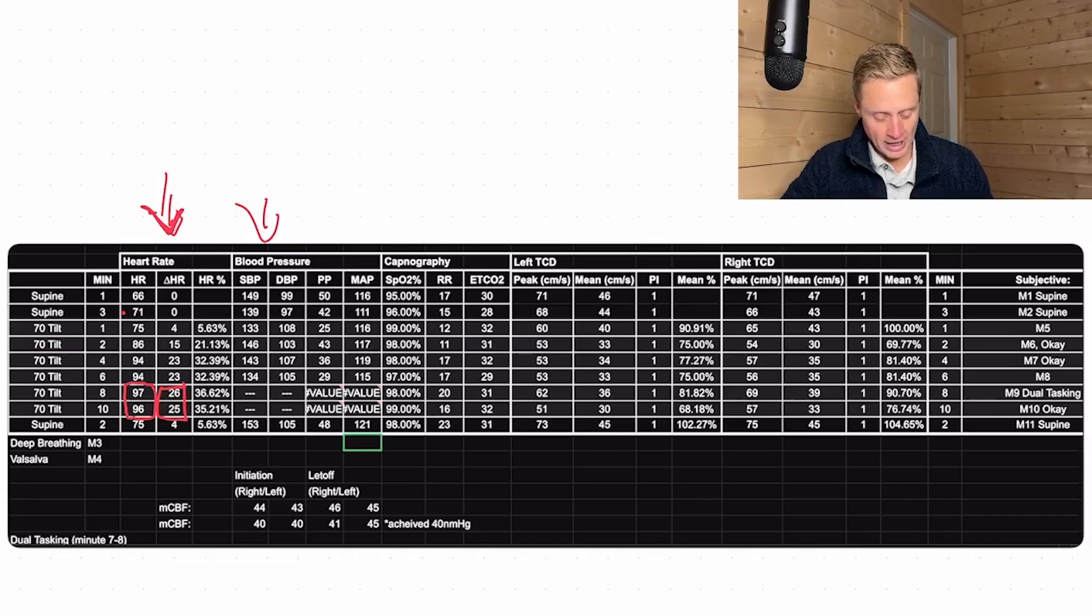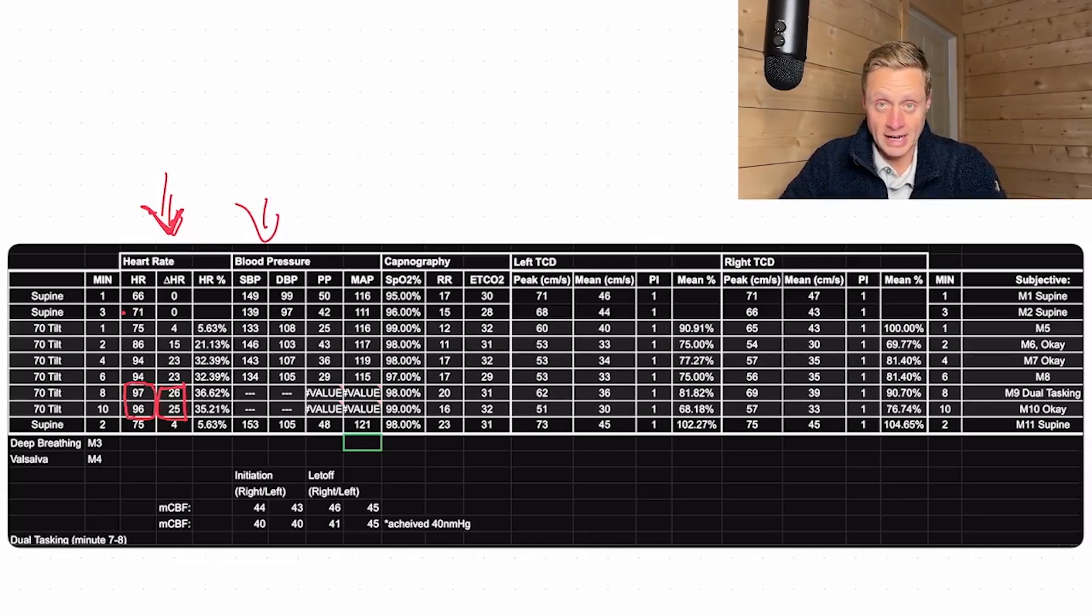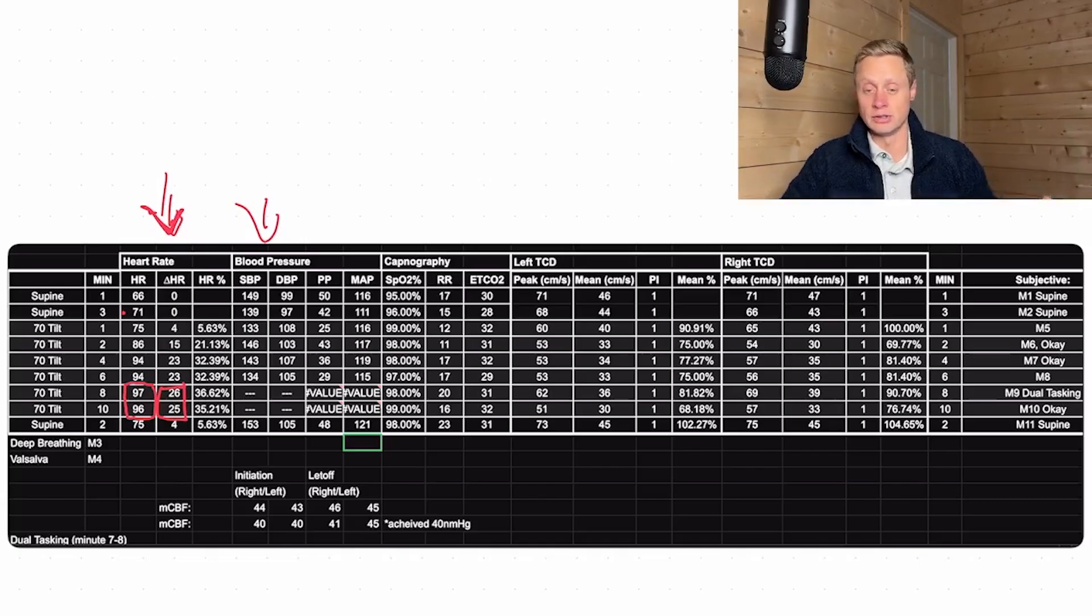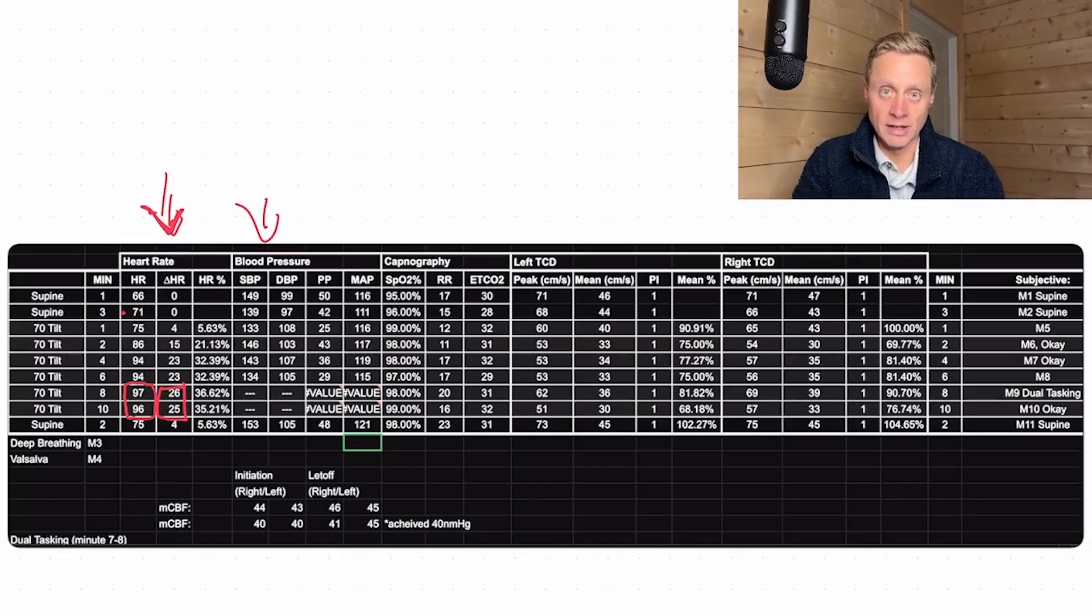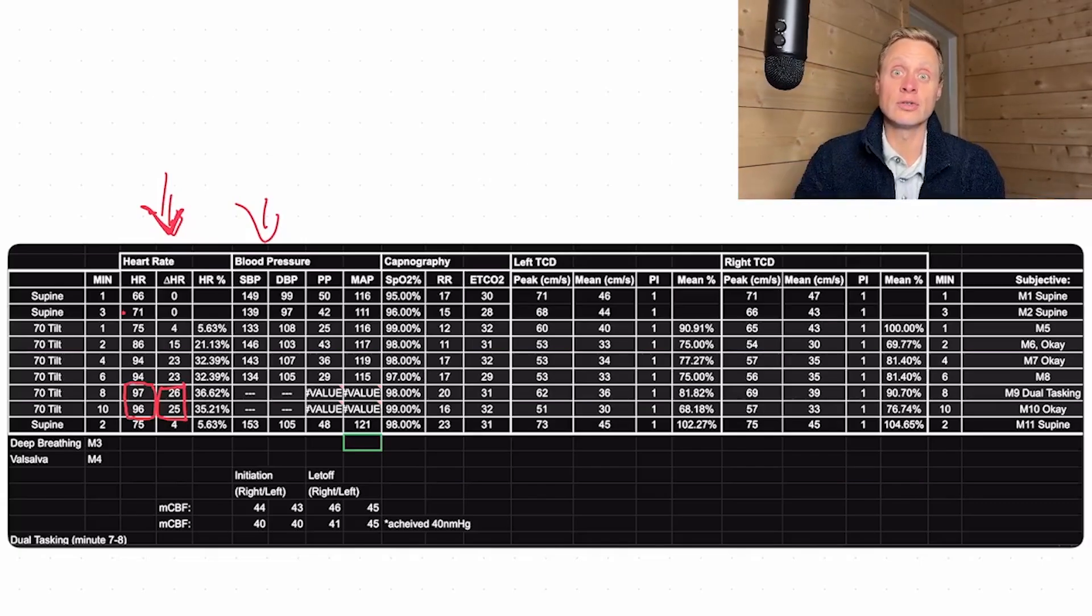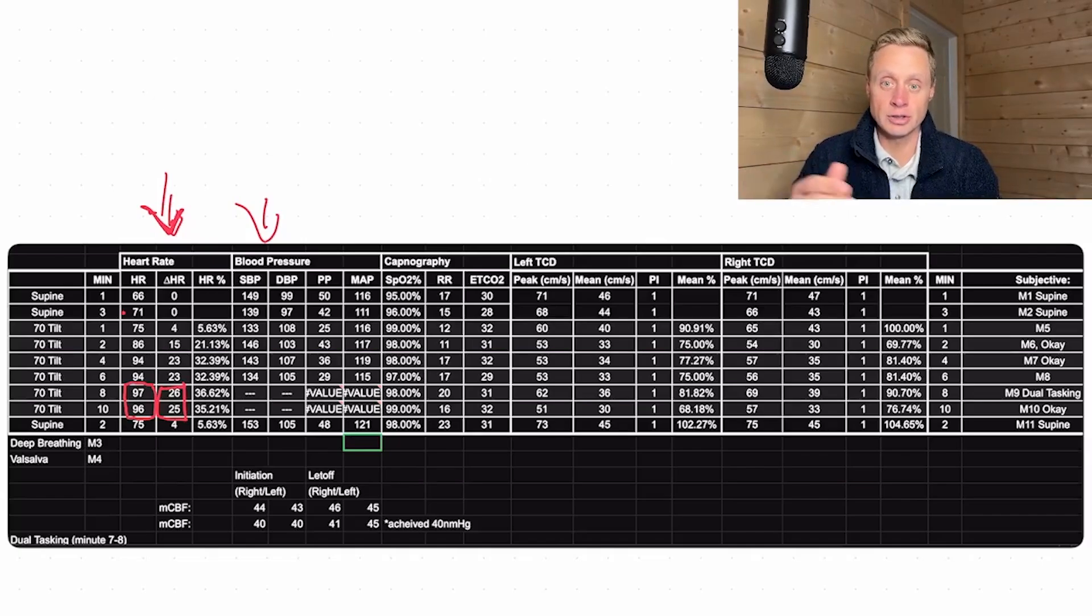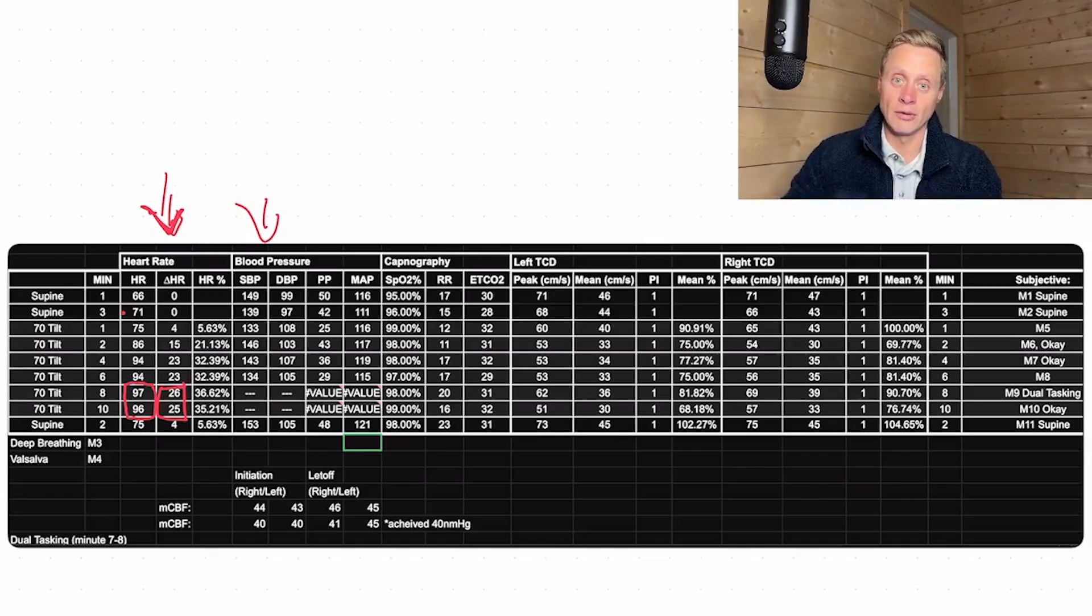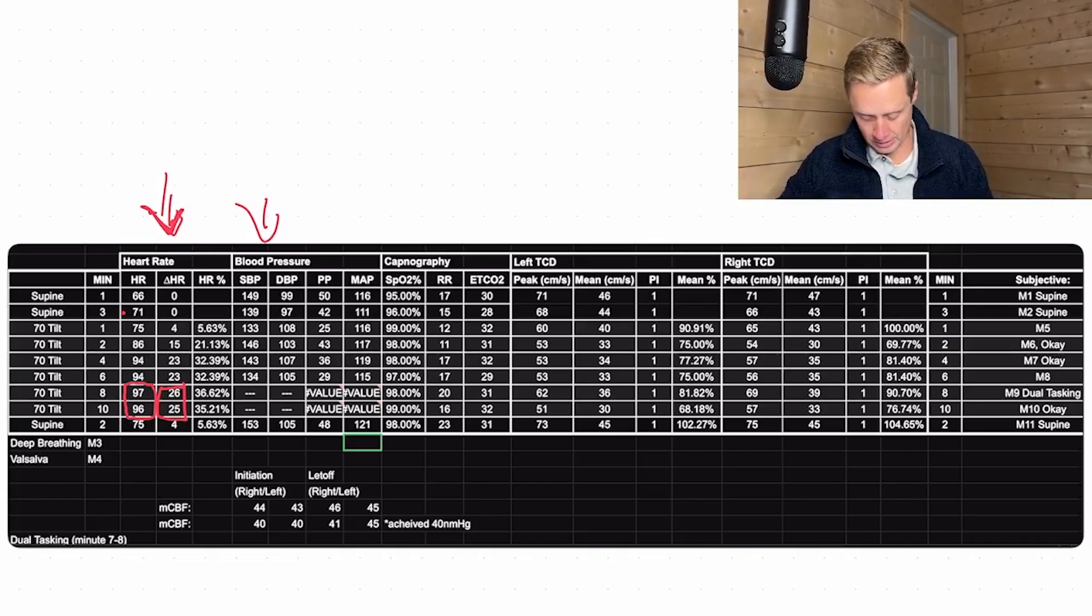We don't have a drop in blood pressure. We go from 139 over 97 down to 133 over 108. We love seeing that diastolic number come up, which is brilliant, because that way we know that those peripheral blood vessels are constricting the way they should to be able to maintain blood pressure throughout the body.